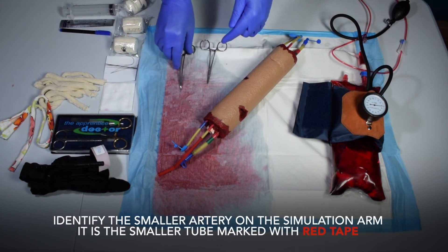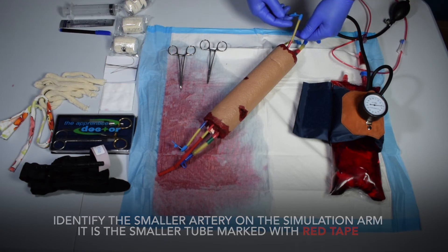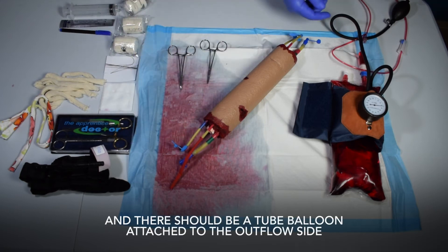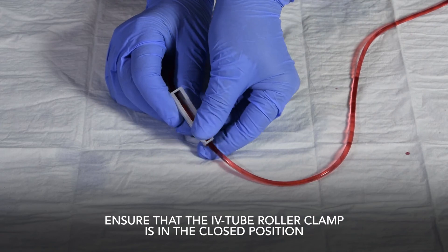Identify the smaller artery on the simulation arm — it is the smaller tube marked with red tape. The connector on the inflow side of the artery should be open, and there should be a tube balloon attached to the outflow side. Ensure that the IV tube roller clamp is in the closed position.